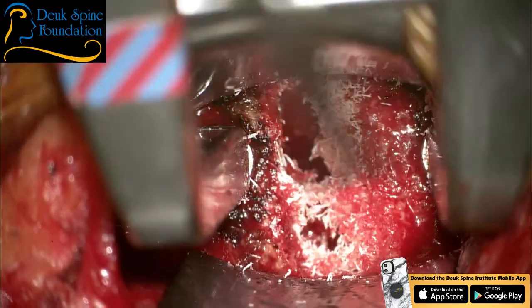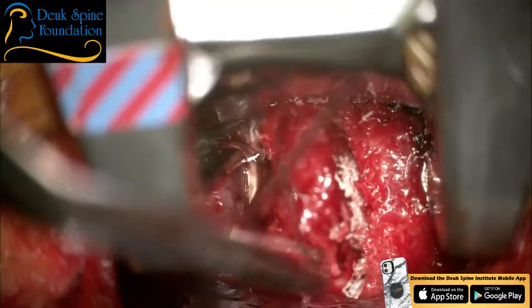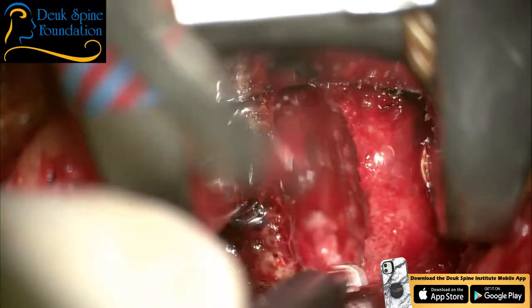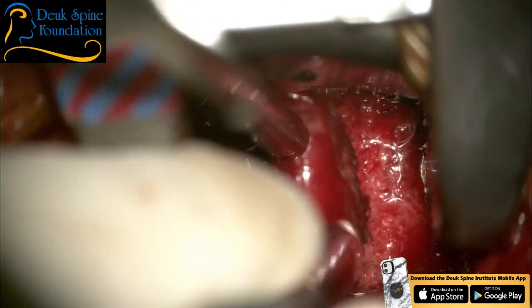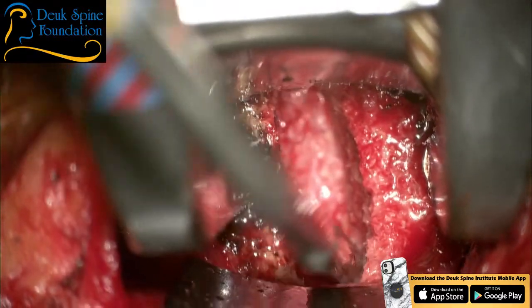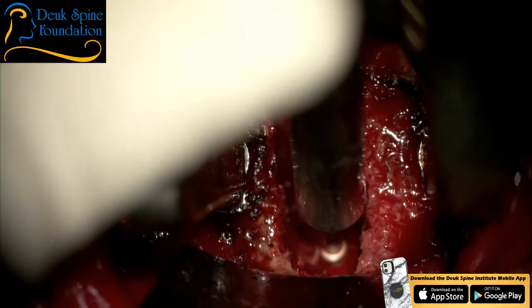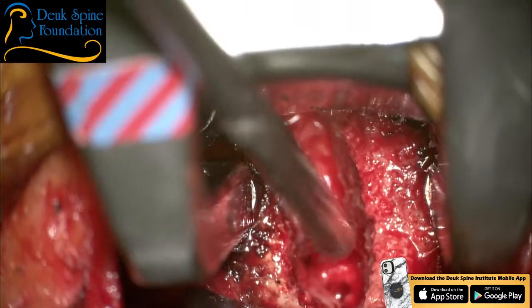Okay. Suck all that. Gentle irrigation. May not be done. Irrigate. Suck, suck, suck. Show me my work. All right. I'm going to take a little more down right here. You can see it needs to be removed, contoured. Okay. Show me. Yep, I'm going to take a little bit more there. This drill is called a neuro bit. Take that. I need a Kerrison.